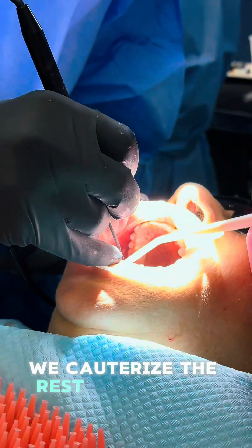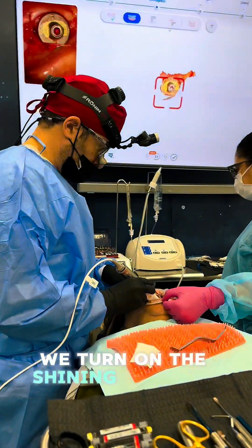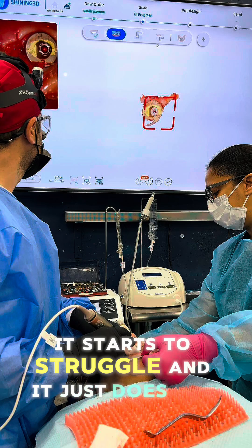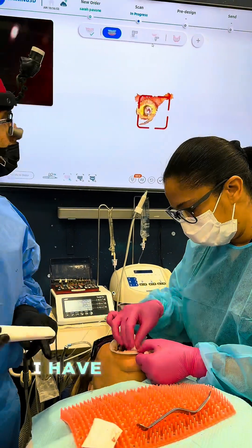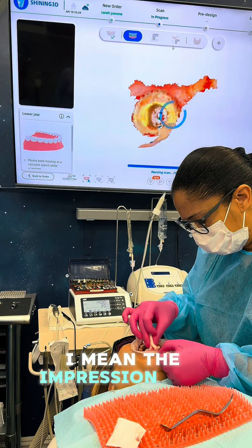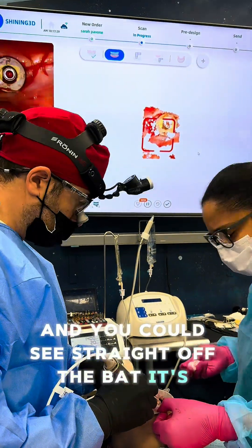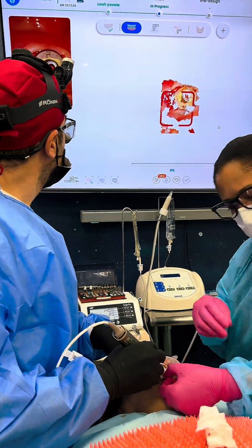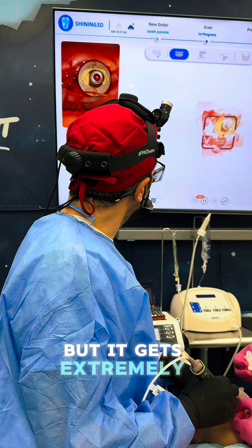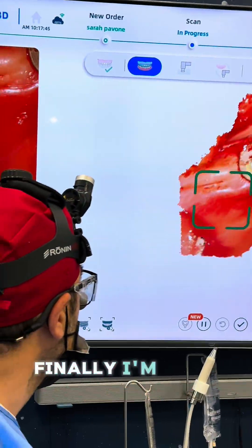We cauterized the excess soft tissue and started scanning the lower arch. We turned on the Shining and you can see straight off the bat it starts to struggle and just does not want to move. I deleted the scan and started again - it's getting confused. On the left-hand side the picture is perfectly clear with no blood, which is the beauty of the THS, but it gets extremely confused again and finally I was able to get through.